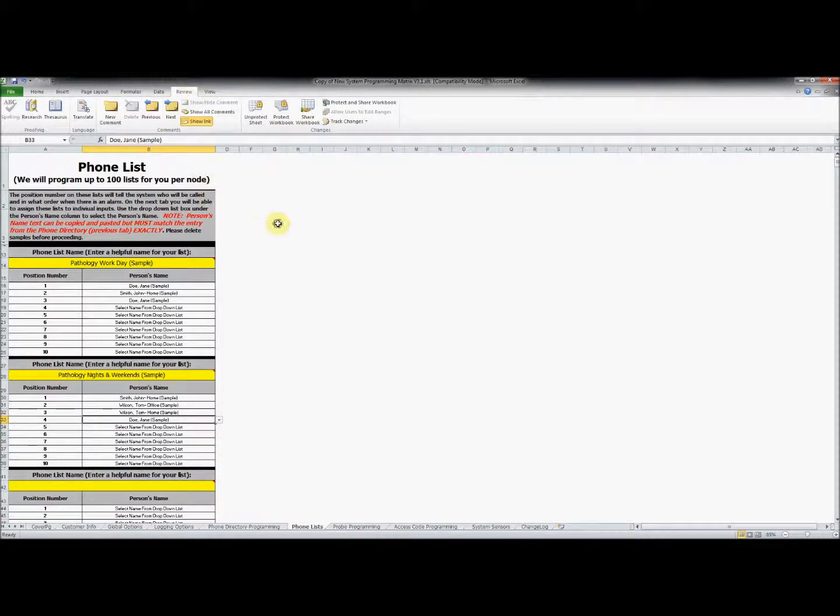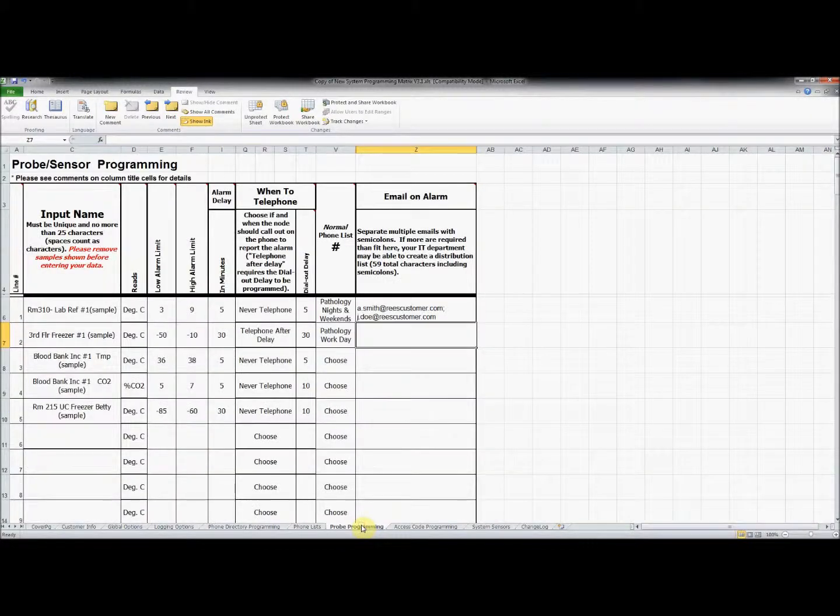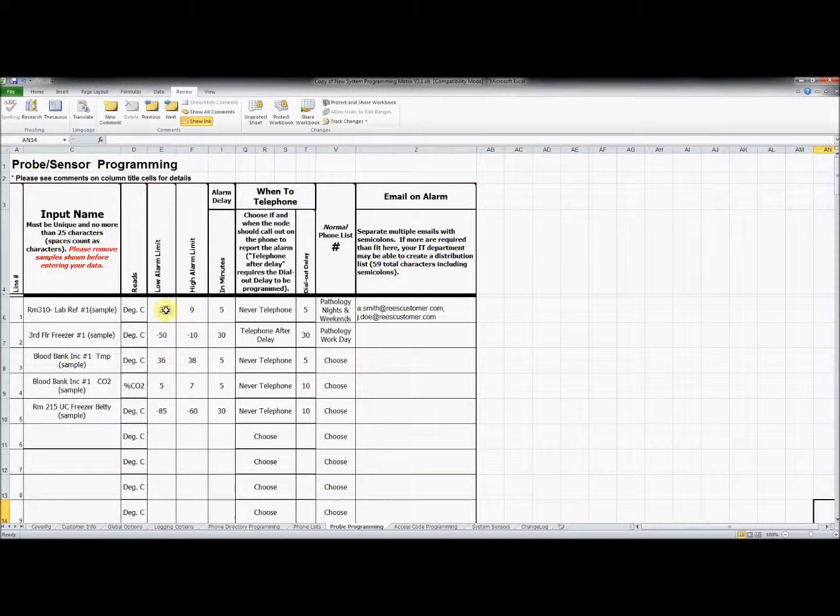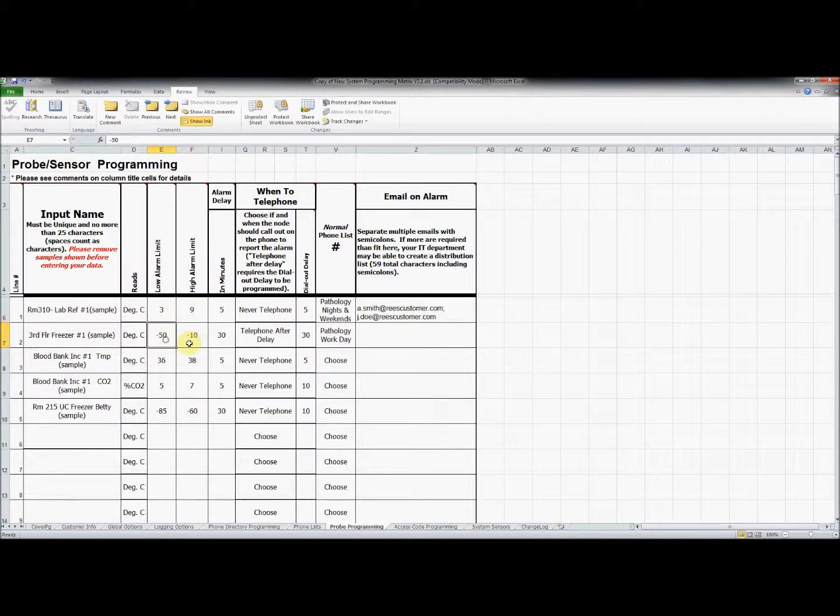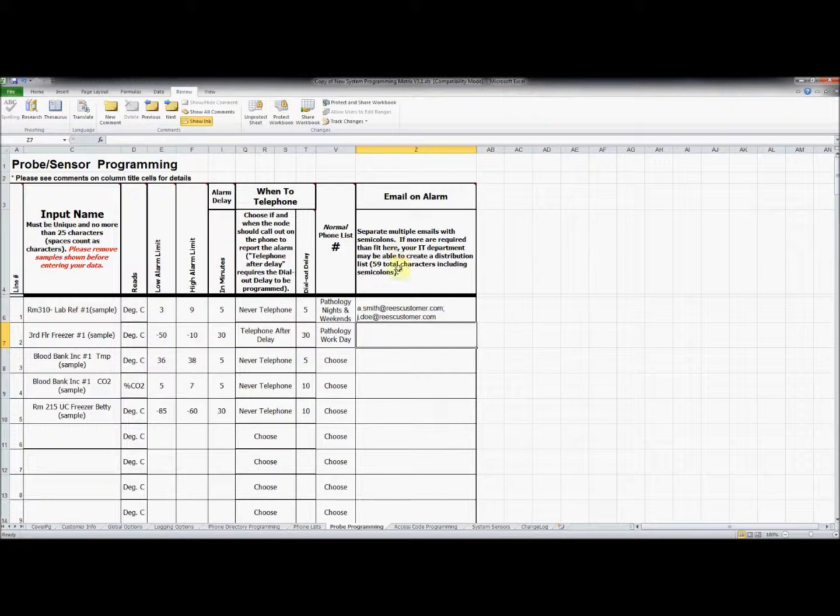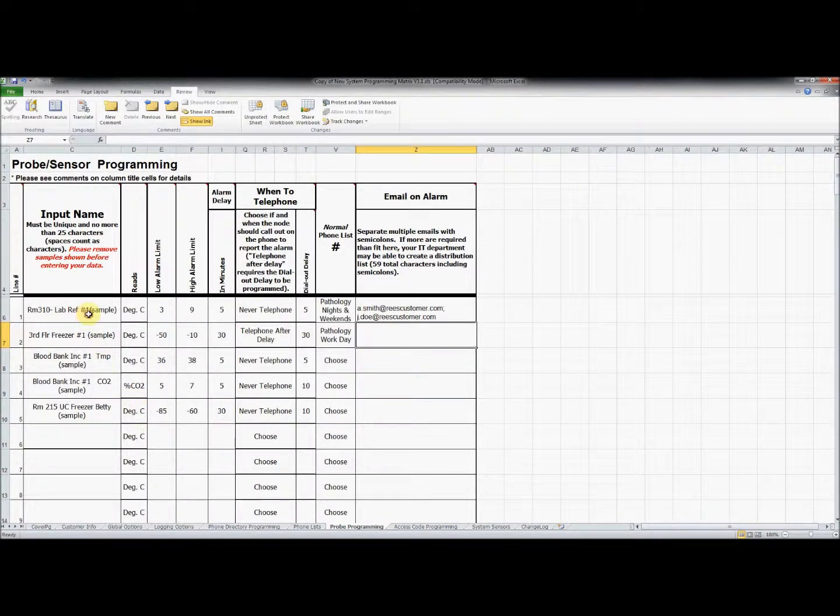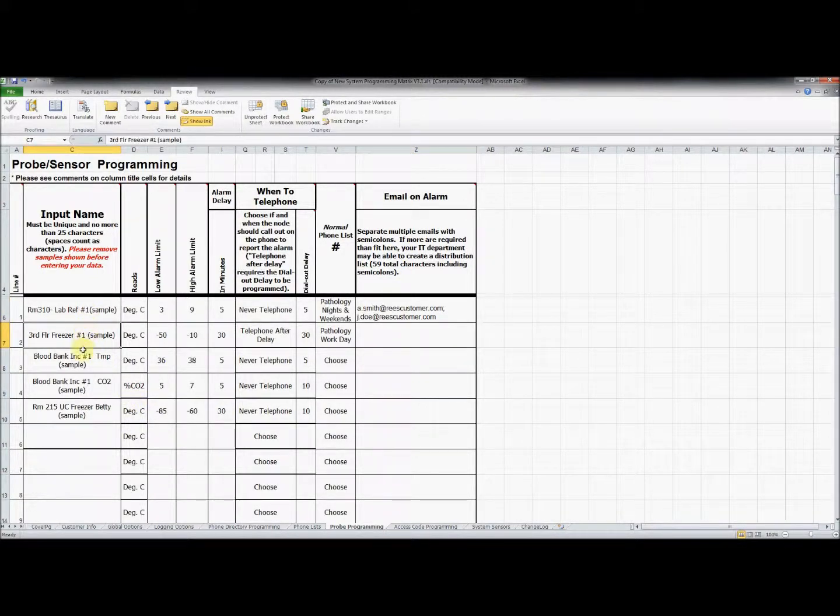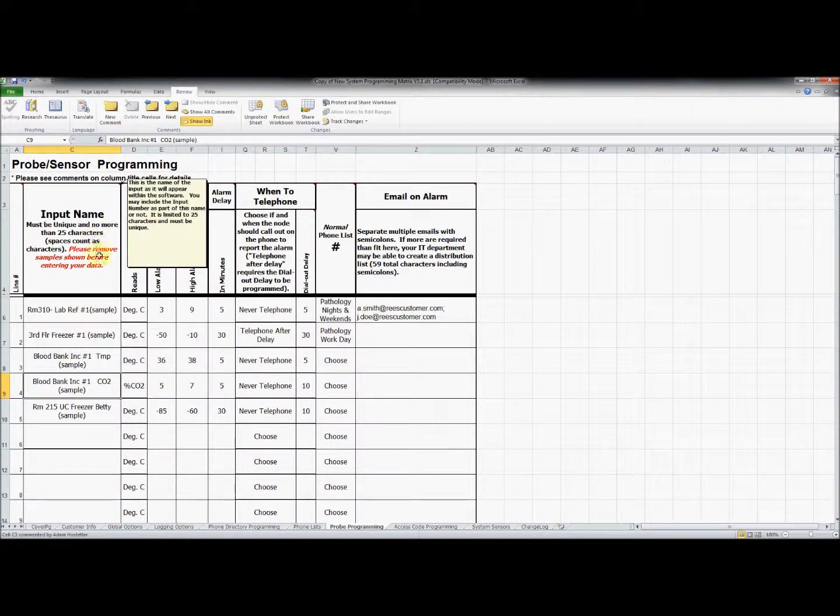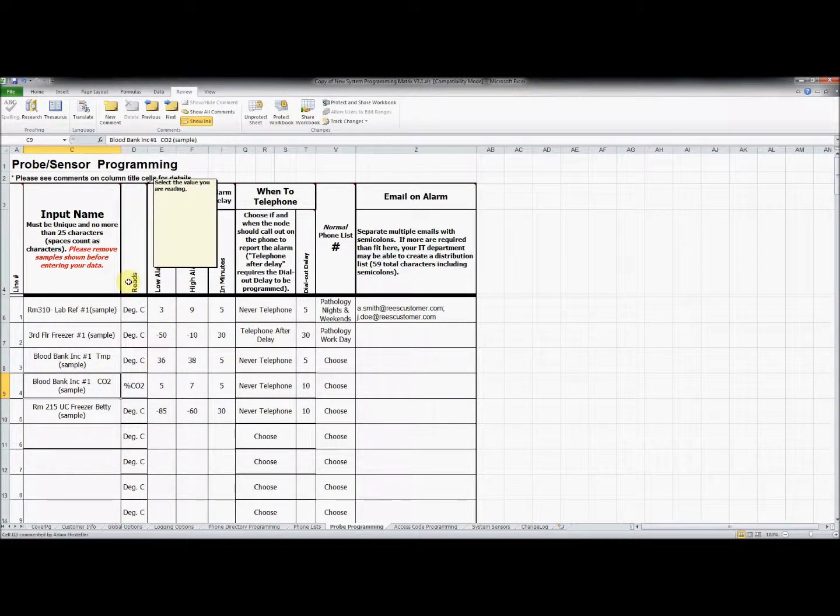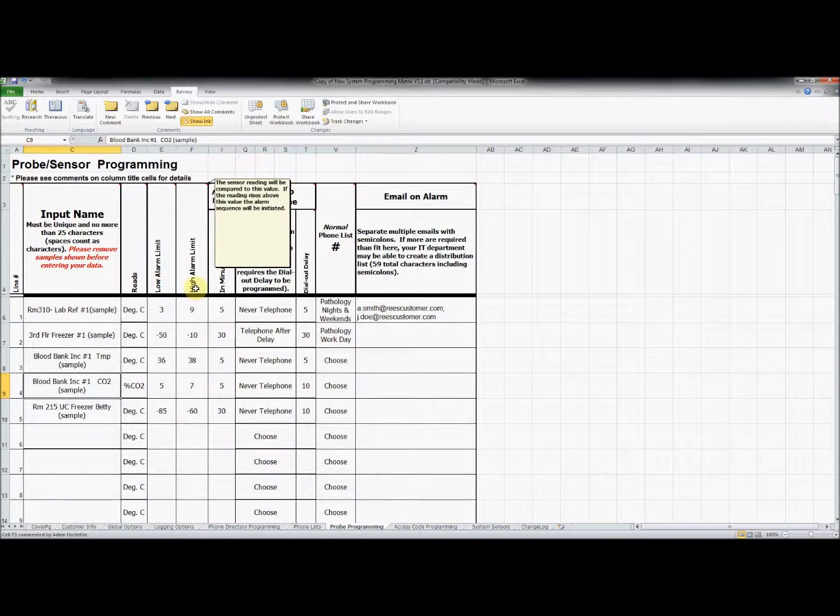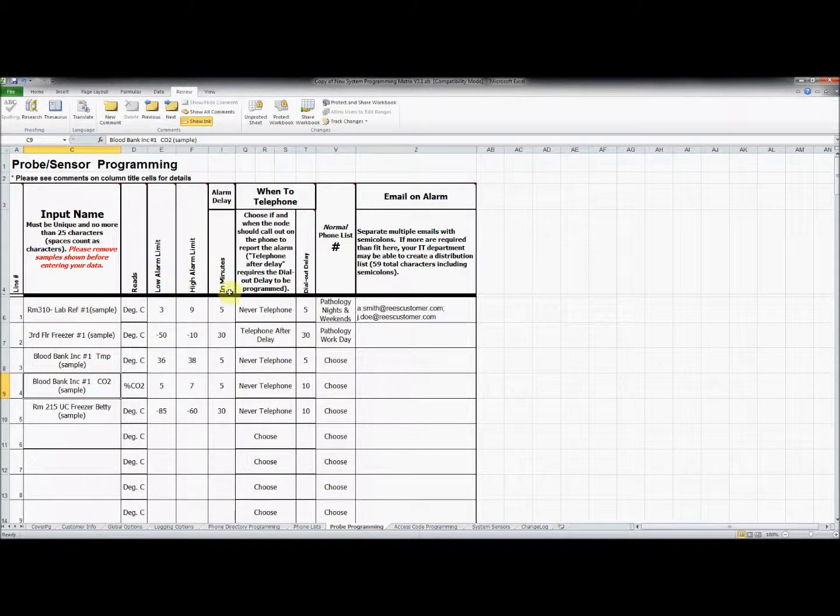These phone lists will be assigned to specific inputs in the probe programming tab. In this section of the document we will specify alarm ranges and alarm notification options. A few lines have been filled out for you as an example. Remember to remove all of this information and replace it with your own. If you mouse over each of the heading boxes you will find descriptions to further assist you in this process.